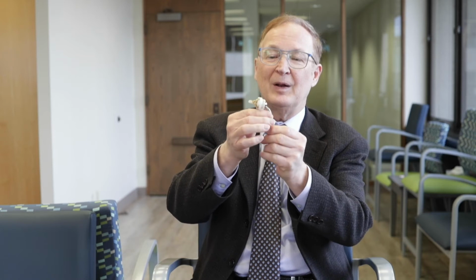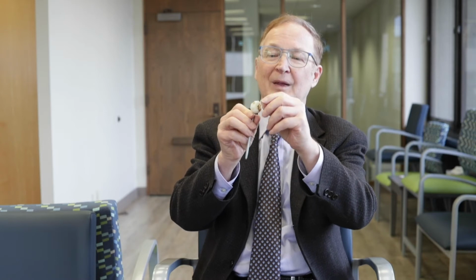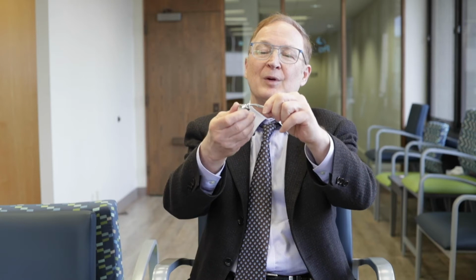This is a very small shoulder, and you can see the plastic material. This time, he actually had the socket so it would snap onto the ball, so it would be very secure. He spent a lot of time trying to decide. This one has some cement on it and a peg, and then he would have different things that he tried from time to time. Here's one that has some screws, and the joint itself is metal in that case. There's another one of his variations. I'm showing you all these in this box because none of these worked out the way he wanted.